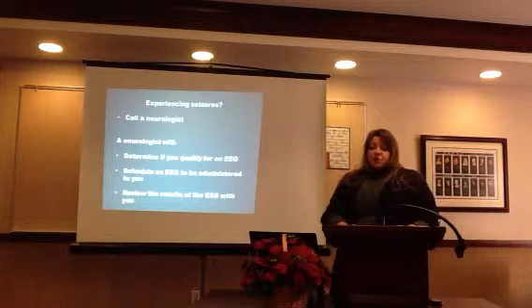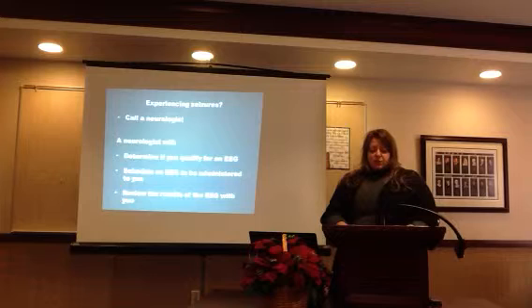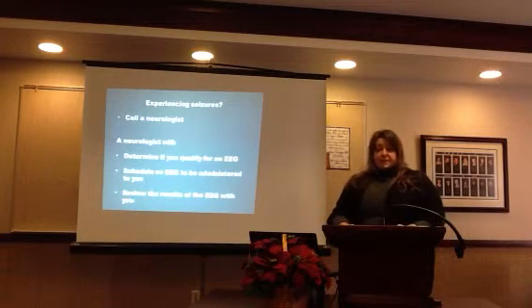If you suspect that you or someone you know is experiencing seizures, it's really important that you visit a neurologist. The neurologist can help you determine whether or not you need to have an EEG. They can help you schedule an appointment to have an EEG administered to you, and they can review the results of the EEG with you, and if necessary, discuss possible treatment.